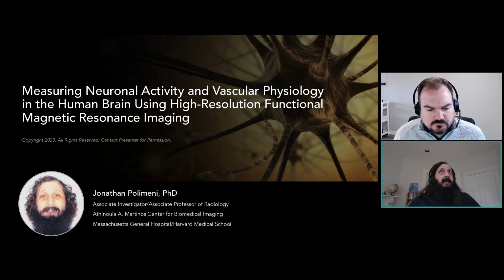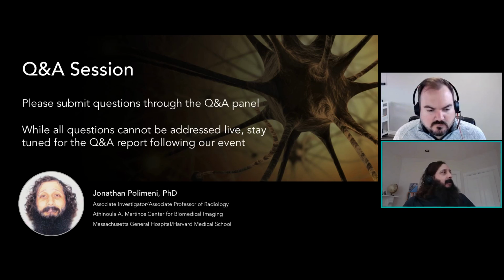Now, in terms of precluding, I referred to the CAA, this reduced vascular activity, as a form of neurovascular uncoupling, and maybe that's a bit of an extreme viewpoint. We do see that there's a delay in the hemodynamics, whereas there's still a coupling. It's just an impaired coupling. In other cases, famously in tumor patients, we do see a much more severe uncoupling between the hemodynamics and the neural activity.